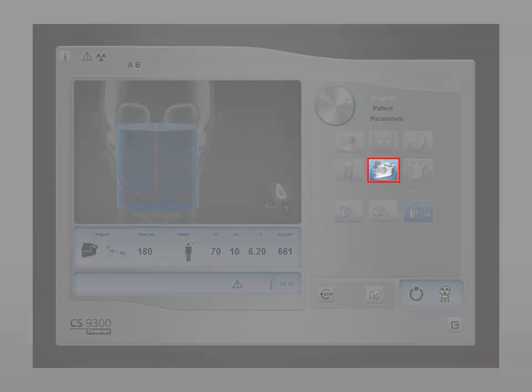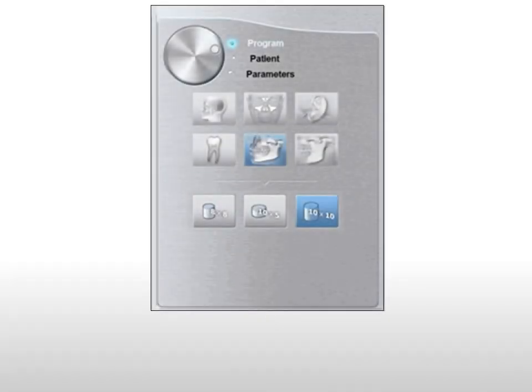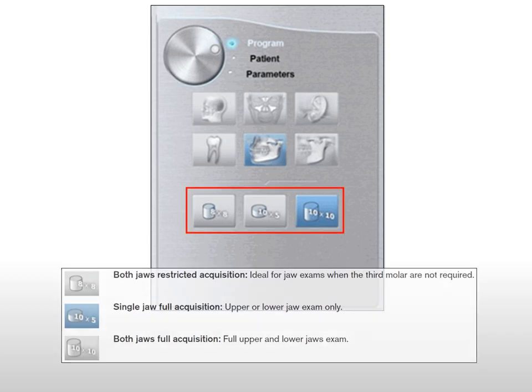Begin by selecting the jaw focus program pane option. Next, select the 3D volume size to be included in the exam. Upper and lower jaw have the same setting and are designated during patient positioning. Use the 8x8 setting for dual jaw restricted acquisition, ideal for jaw exams when third molars are not required. Use the 10x5 setting for single jaw full acquisition, and the 10x10 setting for dual jaw full acquisition.